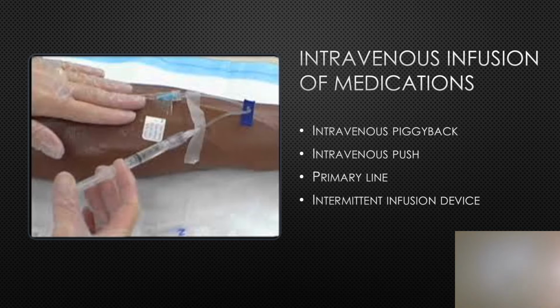Make sure you limit distractions during preparation, and refer to the pharmacy, drug book, drug label, or manufacturer's direction to make sure that you're using the proper diluent, proper amount, etc. Use aseptic technique. Remember that a rubber stopper under a vial cap is not considered to be sterile.